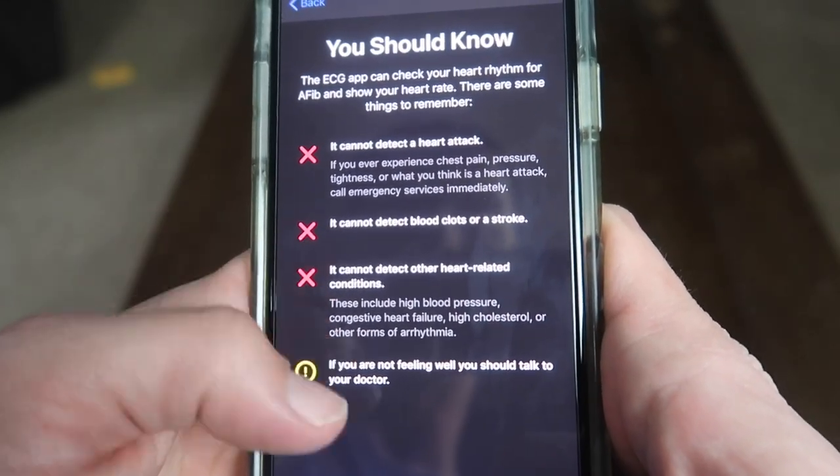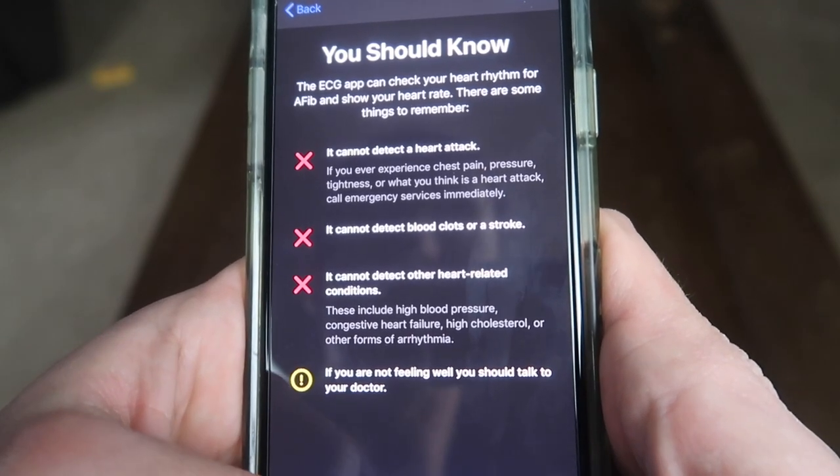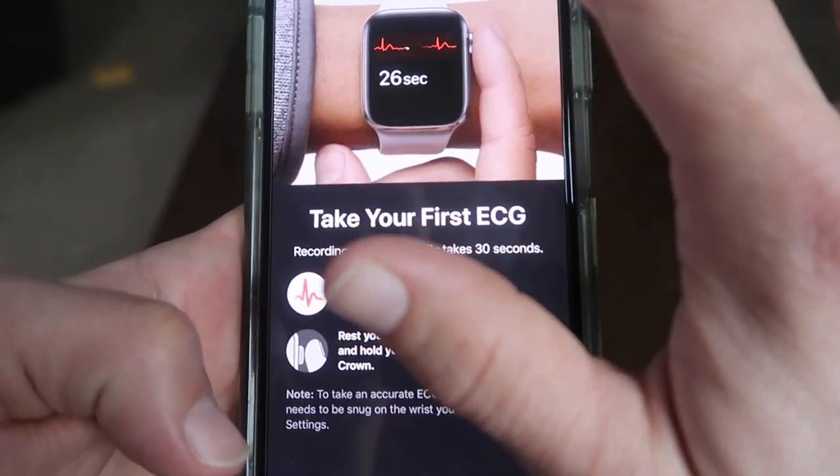You should know it cannot detect a heart attack, blood clots, stroke, or other heart-related conditions. Talk to your doctor if you're not feeling well. No, I can't sue them.